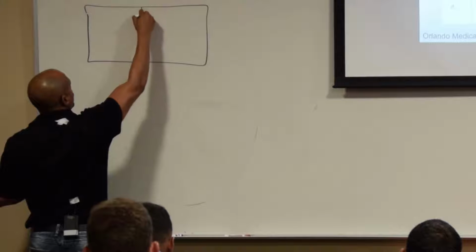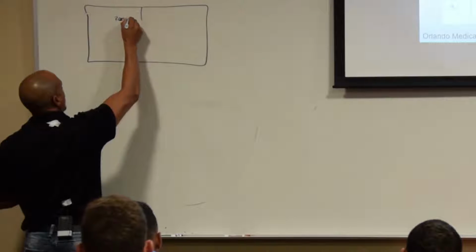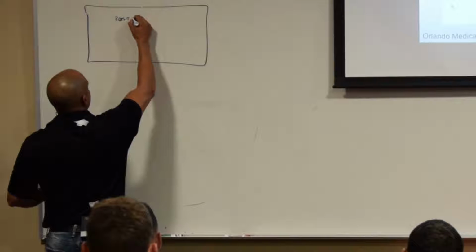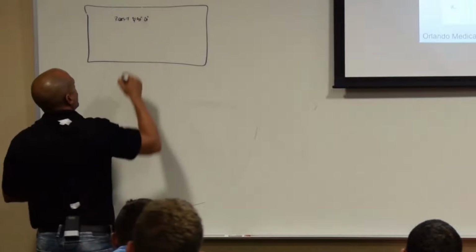Right here, you have a split. It's going to say P dash QRS and then a dash and a T. Everybody with me? And then it's going to give you degrees for this P. Then you're going to get another degrees, 90, and then 20, whatever. You get 3 different numbers.